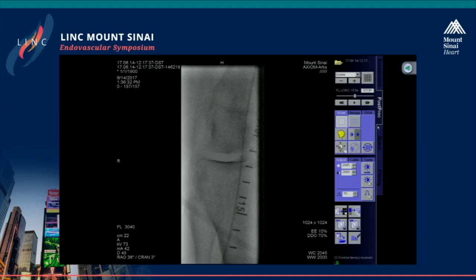Why don't you just put a 014, you can put the same trail. Personally, as there is not a lot of evidence using these debulking systems even in the femoropopliteal area, there is even less evidence to use it in the below the knee area. So I'm completely not in favor of using these kind of devices, and the plain old balloon angioplasty. You can discuss with drug-coated balloons or not, but seems to me a more straightforward and easy way of tackling these kind of occlusions. With an accordingly high restenosis rate, yeah.